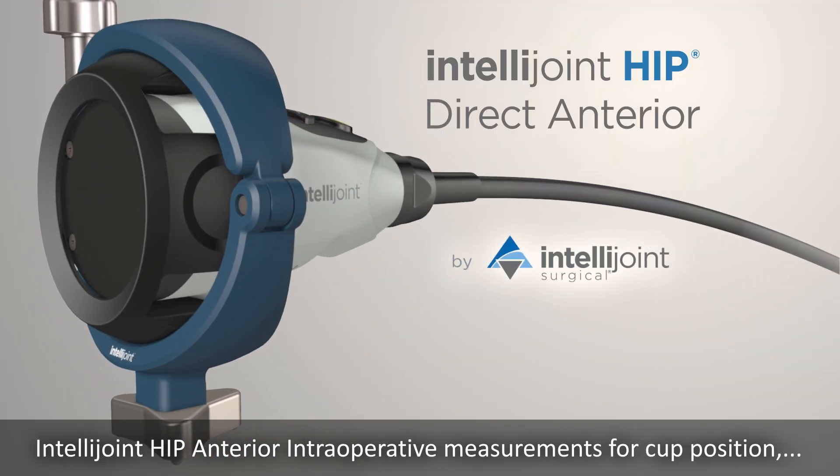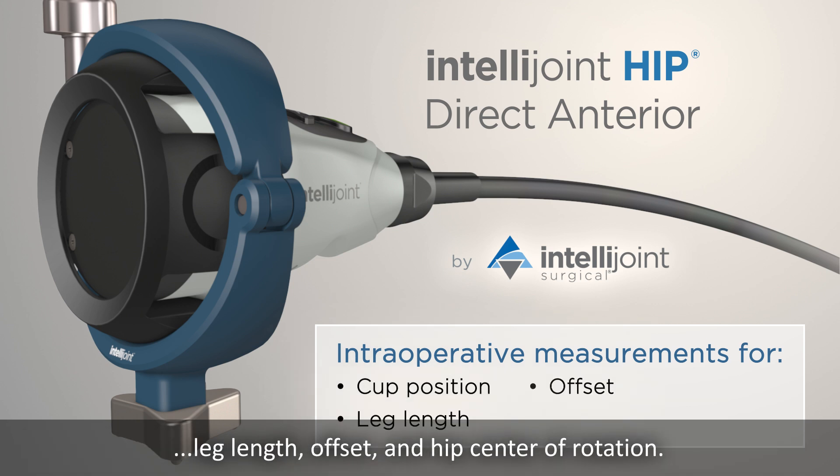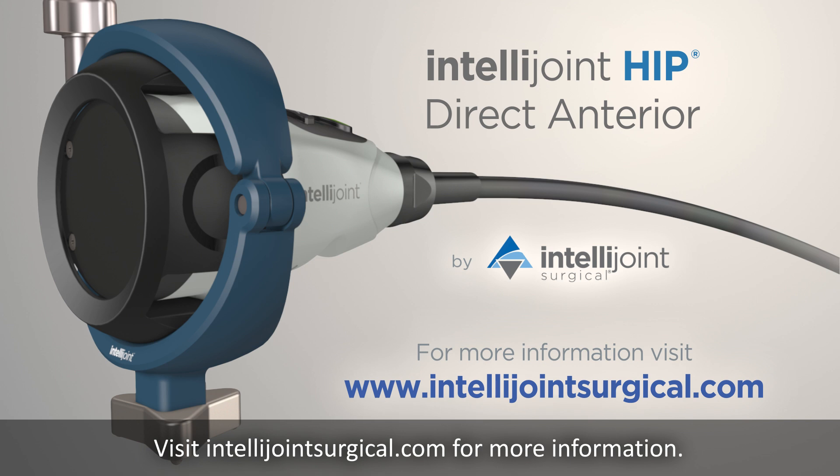IntelliJoint Hip Anterior — intraoperative measurements for cup position, leg length, offset, and hip center of rotation. Visit IntelliJointSurgical.com for more information.